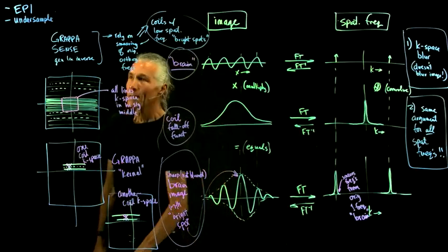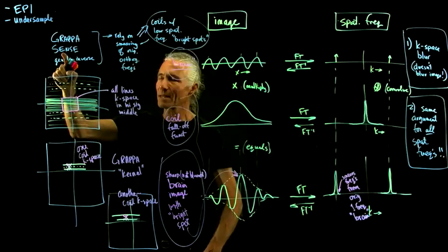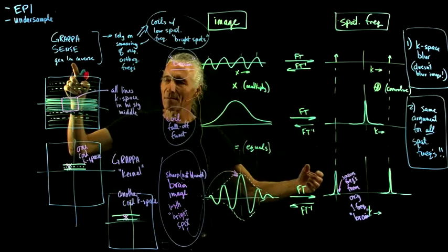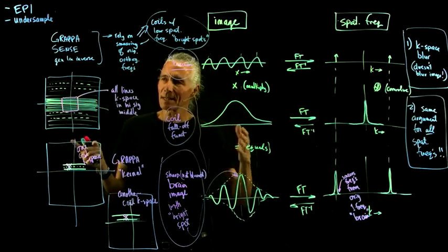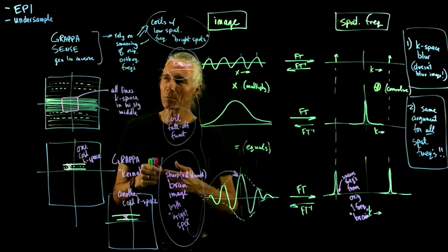So all of these methods, GRAPPA, SENSE, which is kind of like a general linear inverse, or just doing this whole thing as a linear inverse, wouldn't work well if it weren't for the fact that the data has been smeared. And what's causing it to be smeared is counterintuitive, but it's a very gentle fall-off function that extends across the whole brain, basically. A very low spatial frequency fall-off function.